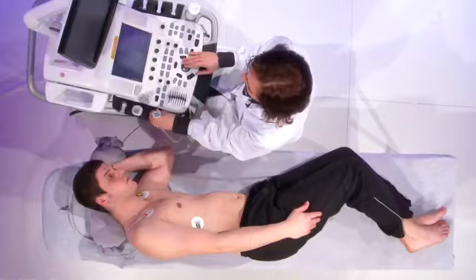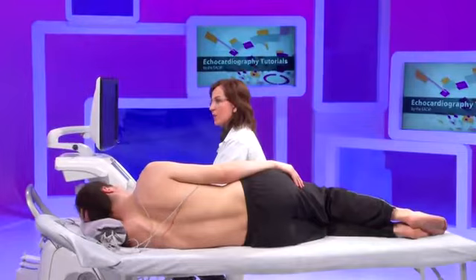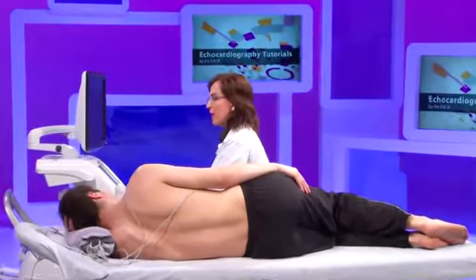Here we have a patient with a tetralogy of Fallot, a 17-year-old. He underwent correction of tetralogy of Fallot very early, at the age of 8 months, by a transatrial approach, and also underwent patch insertion for enlarging the right ventricular outflow tract. And as usually happens, these patients at long term develop pulmonary regurgitation, and this is a follow-up examination in order to assess the severity of the pulmonary regurgitation and the consequences on the right heart chambers.